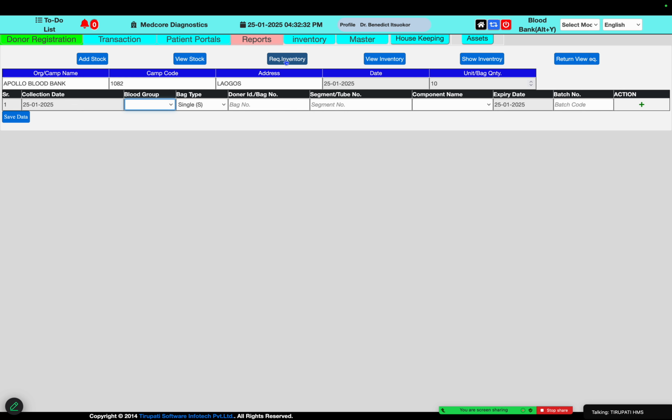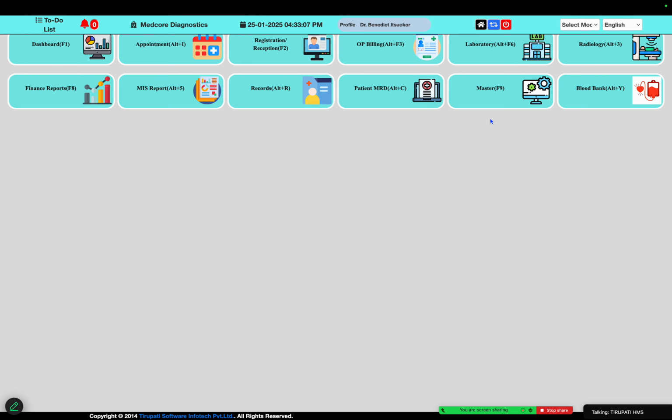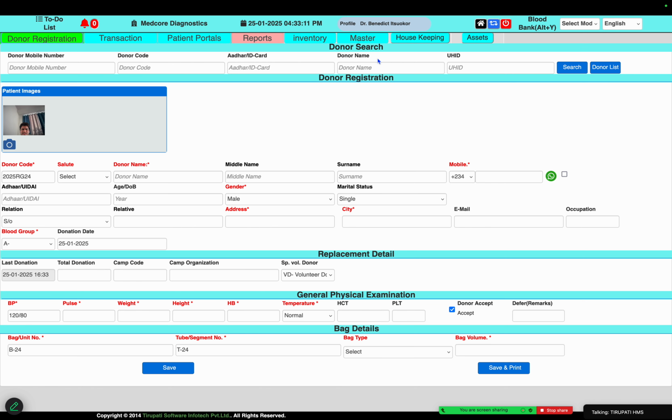In the software, it will relate the inventory connection for blood containers, urine containers, cotton rolls, or bottles like that. Once the inventory request goes to the department, the store in charge will display the inventory module supply quantity for the consumable products in the system. These are the major functionalities of the blood bank window in the system.